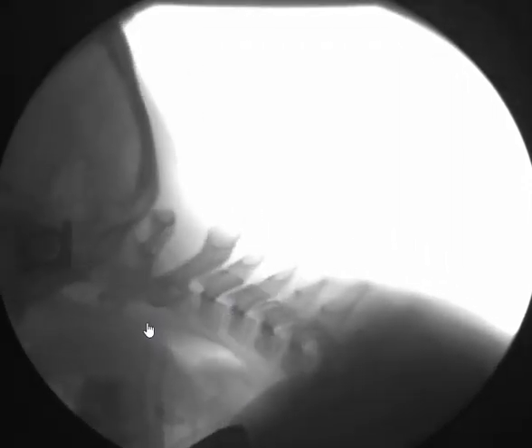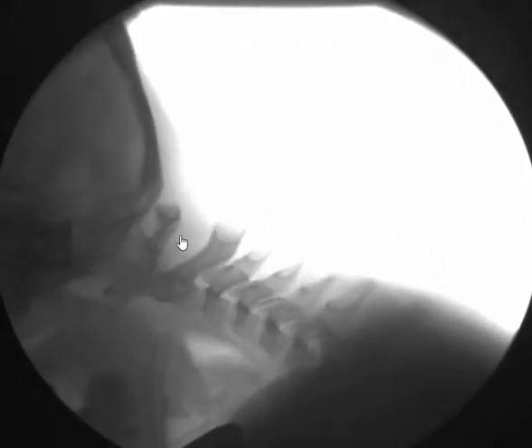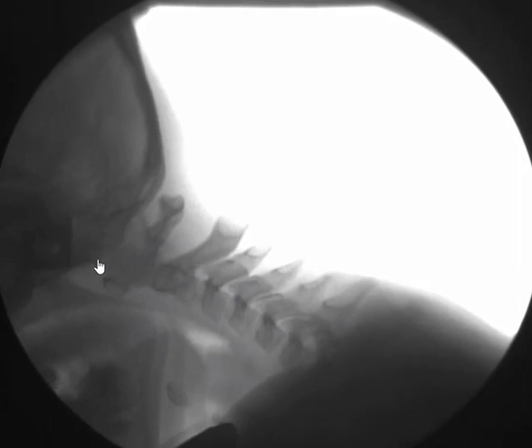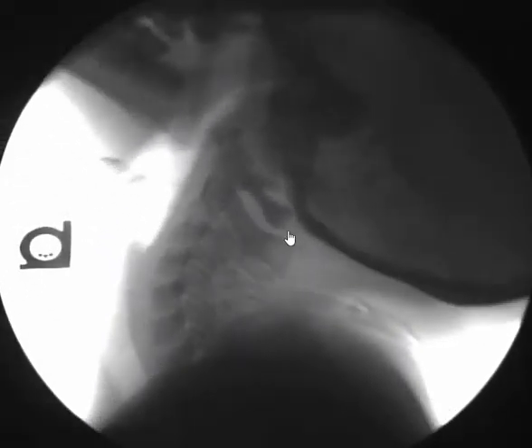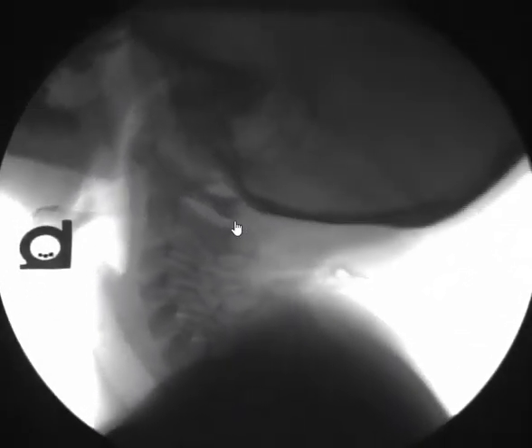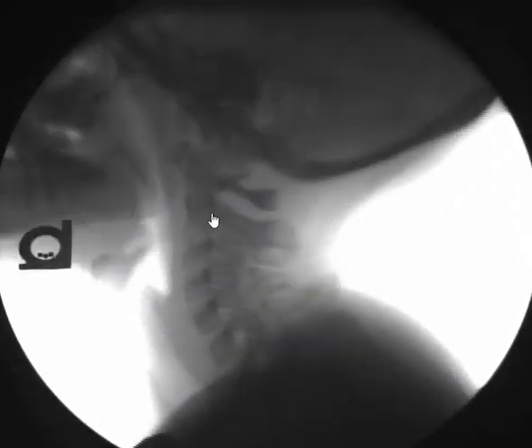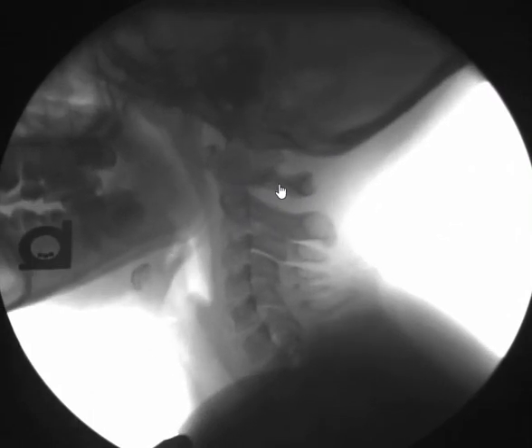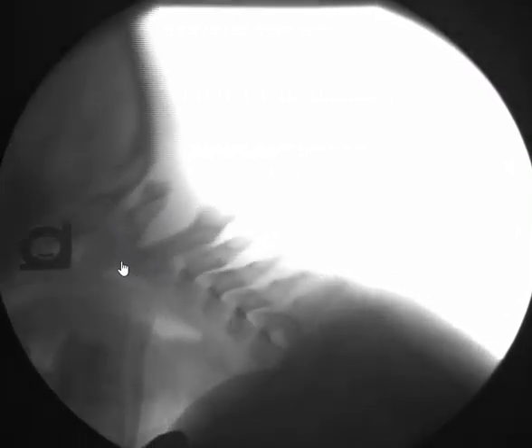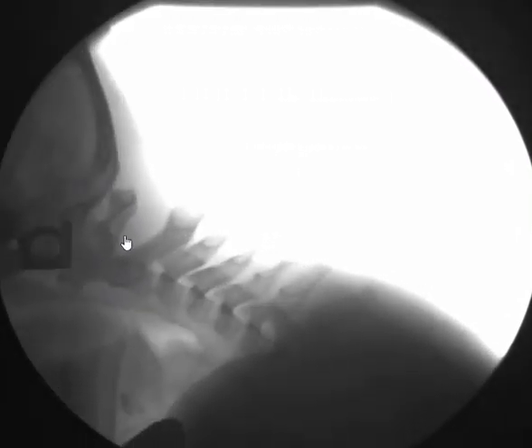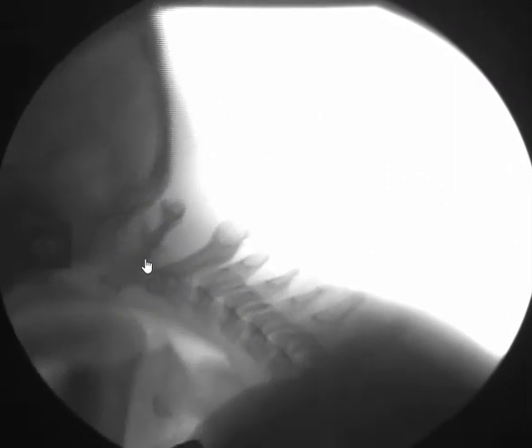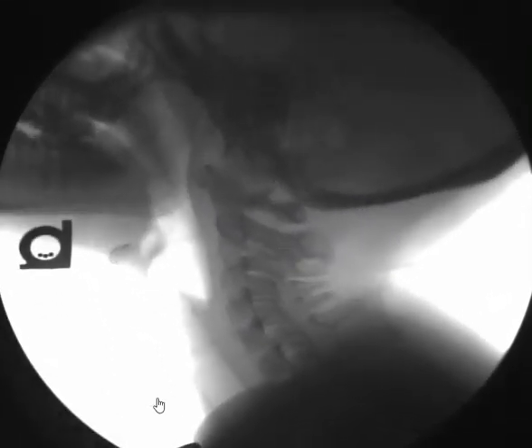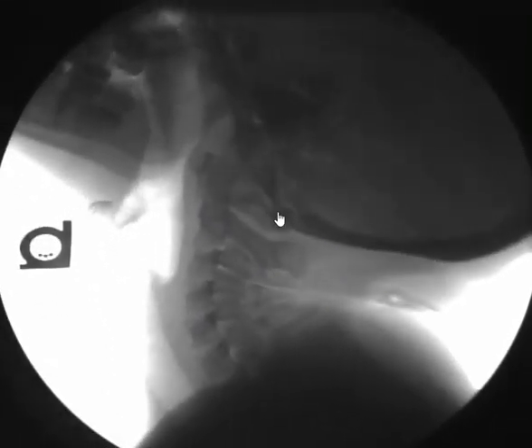Loss of curve — the patient had regular flexion/extension. Watch the facet joints here and watch how this pops. There's a C1 popping that is going to miss, but there as well. Watching from flexion to extension, there's a big ADI space — and watch again: clunk. Those are instabilities.